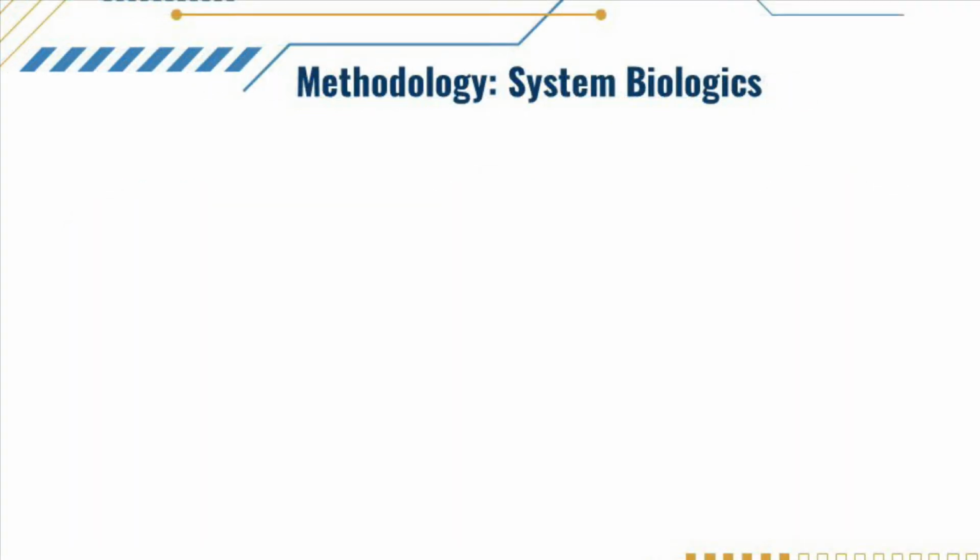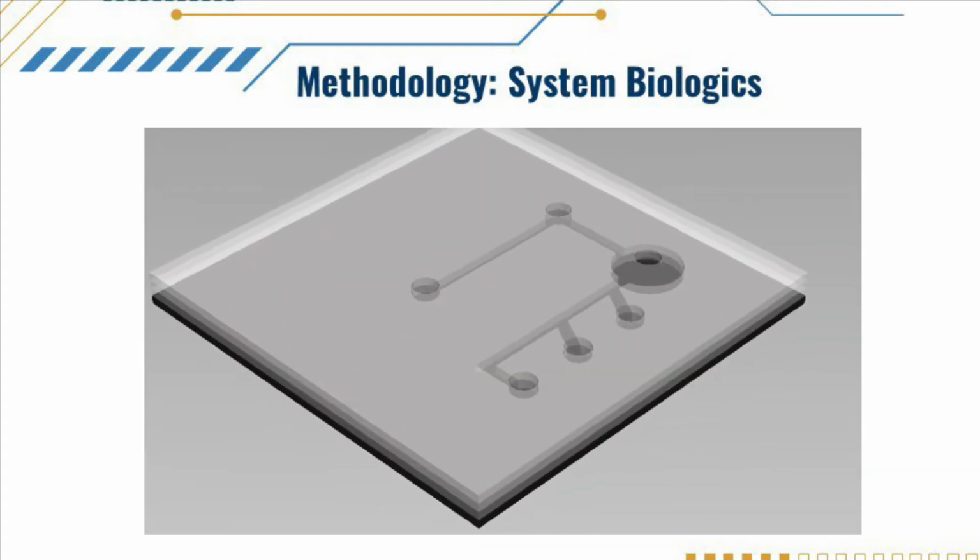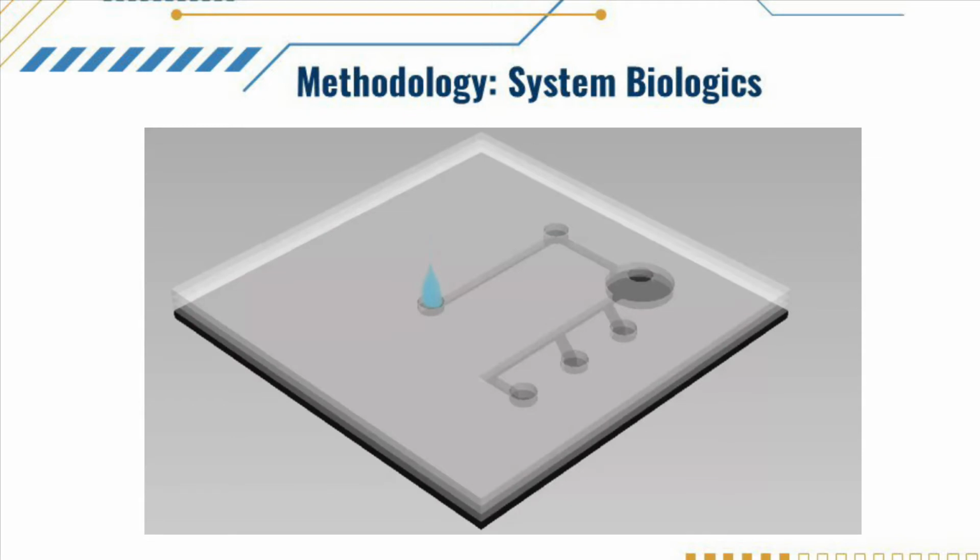The first step was to design the biological system of our device. The science behind our system can be summarized by the following steps. First, a sample of patient saliva is inputted into the microfluidic chip. Viral RNA from the saliva is extracted by an embedded chitosan capillary to be separated from the remainder of the sample. Next, RT-RPA reagents are inserted. These reagents and the RNA continue through the device to the reaction chamber. Here, the RNA is converted to DNA and it is amplified to produce a large amount of DNA via RT-RPA, an isothermal process similar to RT-PCR.